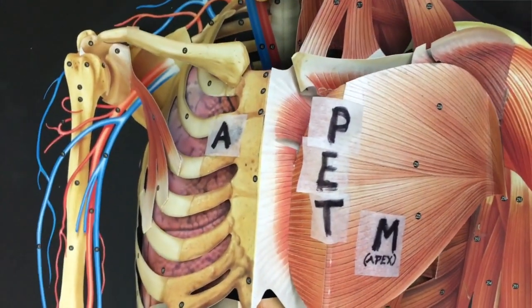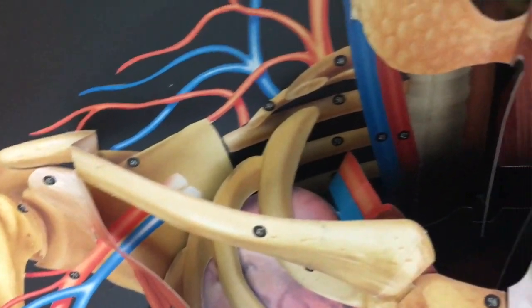When you think of cardiac sounds, you think of the classic lub-dub, or S1 and S2. S1 is the lub, S2 is the dub. Those sounds aren't actually made by the cardiac muscle itself — they're made by the sound of the valves closing. S1, the lub, is made up of the mitral valve and the tricuspid valve closing. And the dub is made up of the pulmonic and aortic valves closing. That's what makes the lub-dub, S1 and S2.